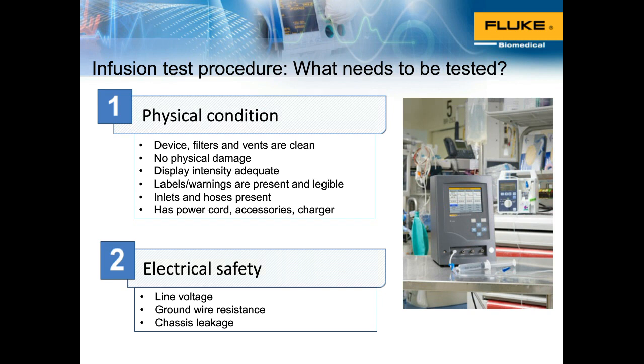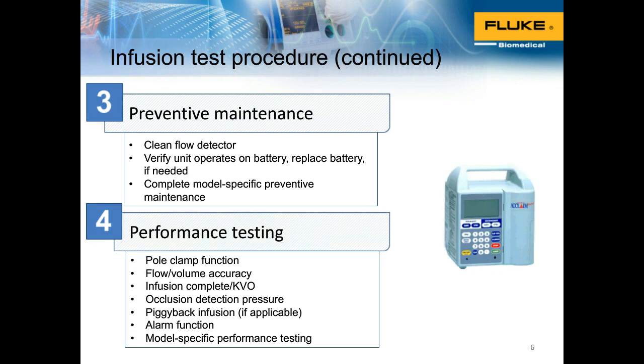Generally, for infusion pumps, we test the line voltage, we test ground wire resistance, we test chassis leakage, and a number of other parameters as well, to ensure that there is no leakage current. Electrical safety analyzers are available in different forms, shapes, and sizes, depending upon your needs.